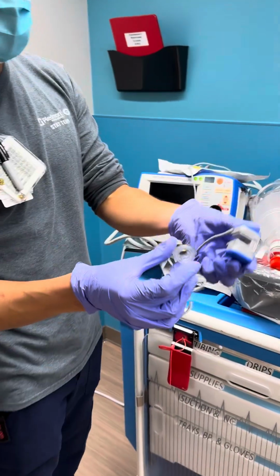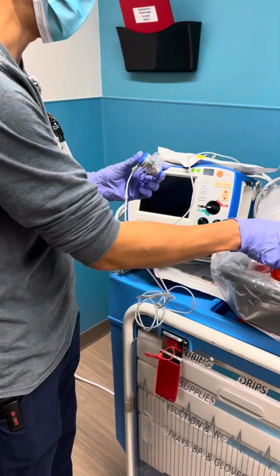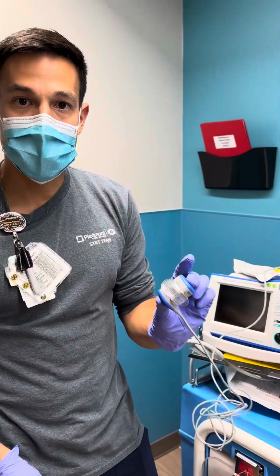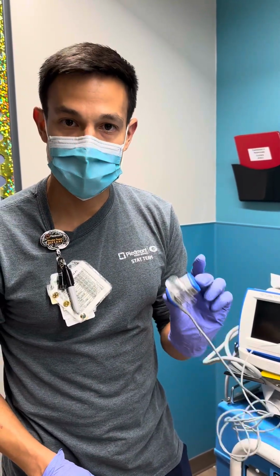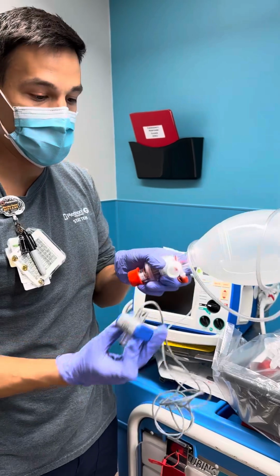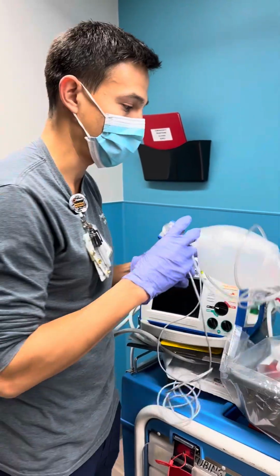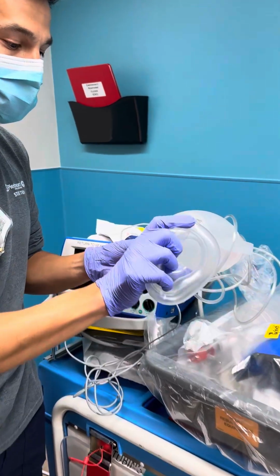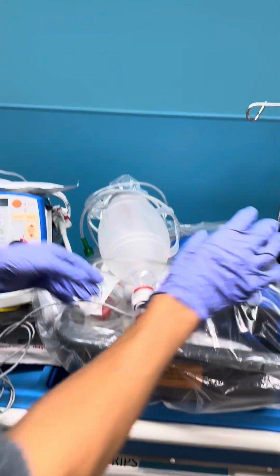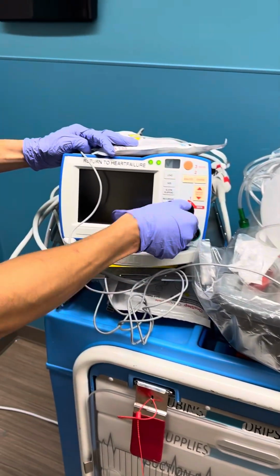This adapter simply sits snugly and will clip into place on the Capnistat 5. You can use end-tidal CO2 monitoring before an advanced airway is in place. Best practice is we can go ahead and get this on as we start to bag our patient. It will only fit on the BVM one way, so we'll fit that snugly into place. Now we'll go ahead and turn on the Zoll monitor.